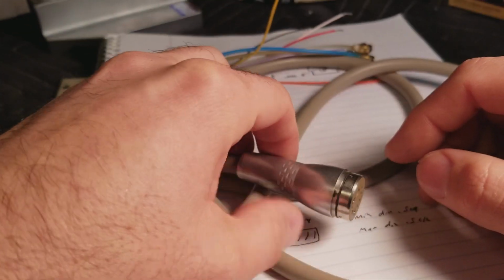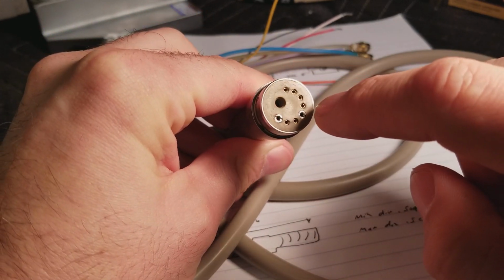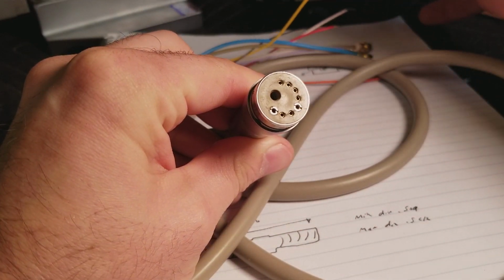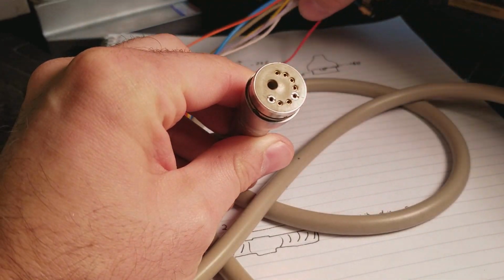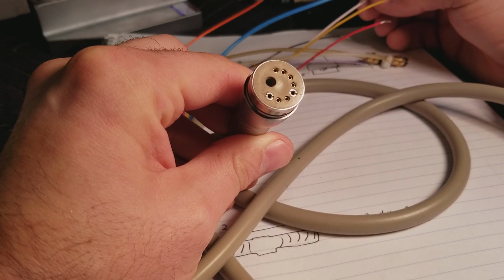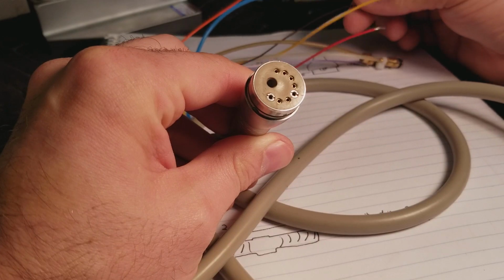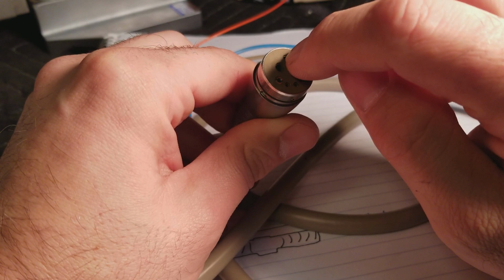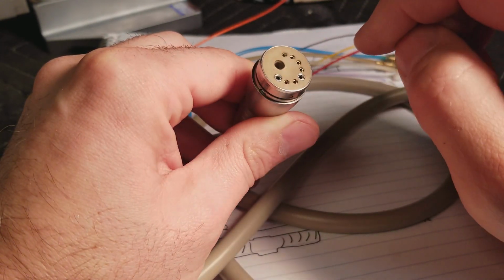So the way to test for that is, you can see in here there's these contact points. Just take a multimeter with continuity mode, take all these leads off the control inside the delivery unit. 4 of them are for the actual motor, and then 2 of them are for the light. I believe it's black and white are for the light, and the other 4 colors are for the motor control. Anyway, you just simply put a lead here and then on one of the wires until you find continuity and go through them all.